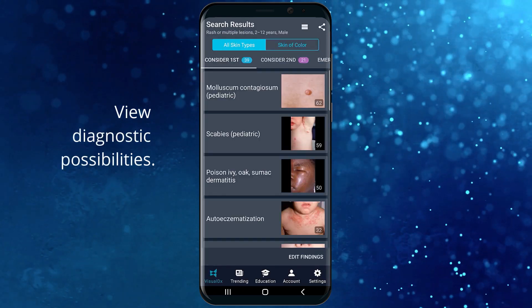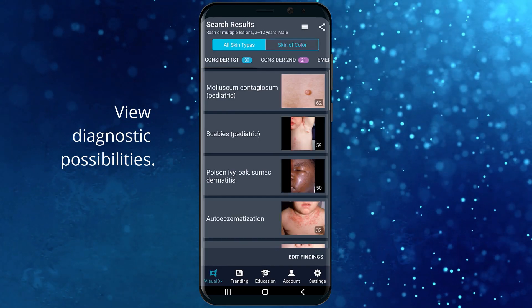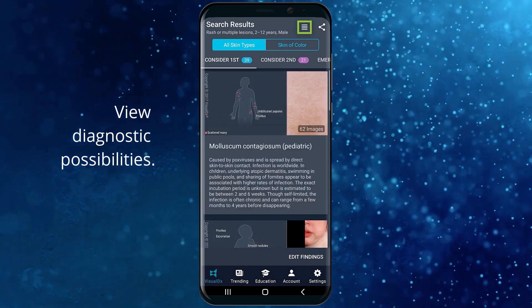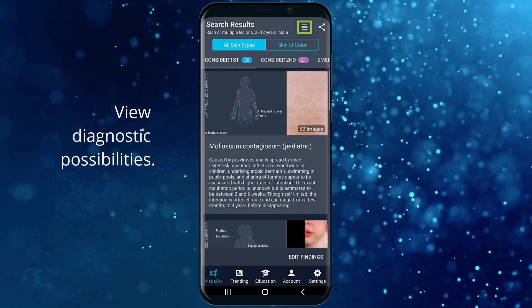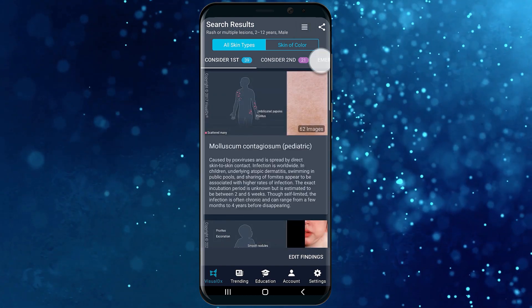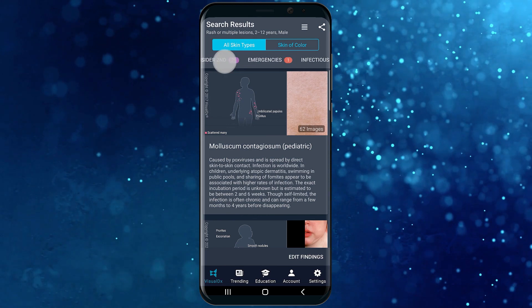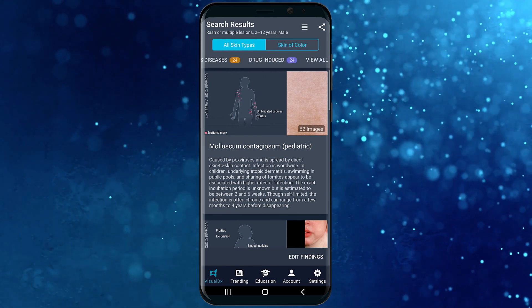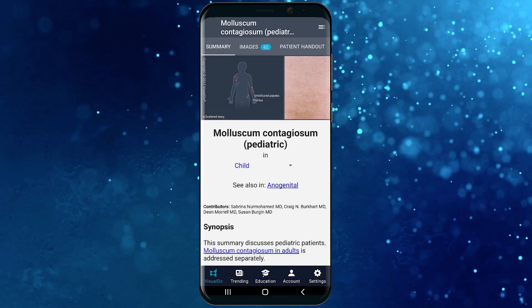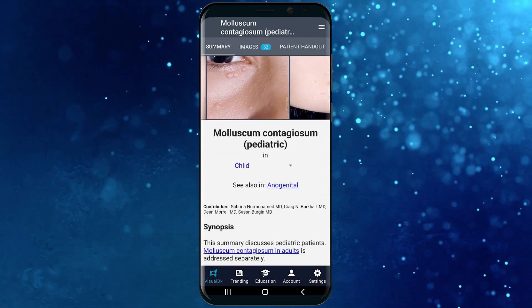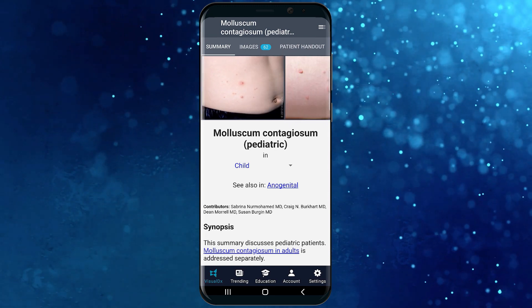The results appear in this list. Expand the quick synopsis view to read more information, or swipe the tabs at the top for an organized look at your differential. Click on a diagnosis for clinical content and images.